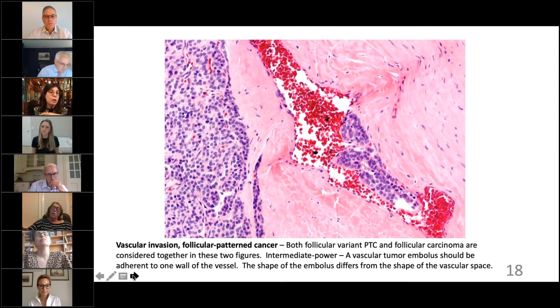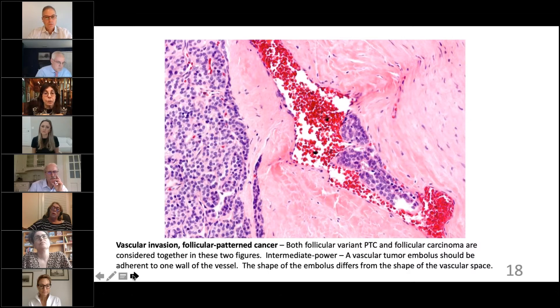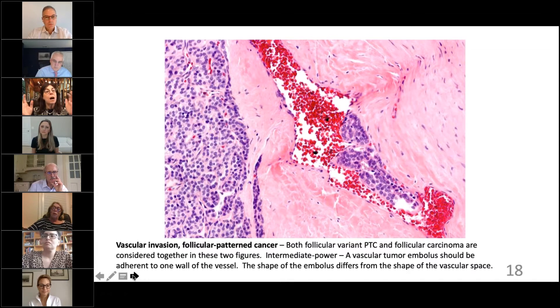Let's talk about vascular invasion. We need to be very specific about whether something is in a lymphatic space or a vascular space. Here I show you a perfect textbook example of vascular invasion.